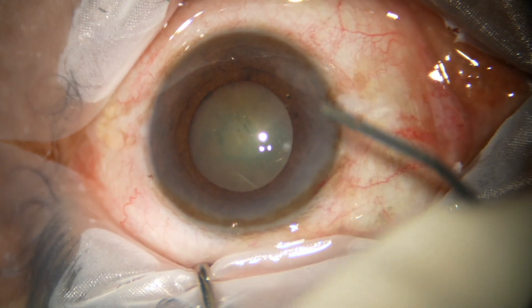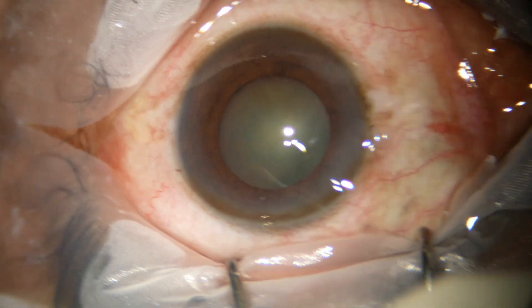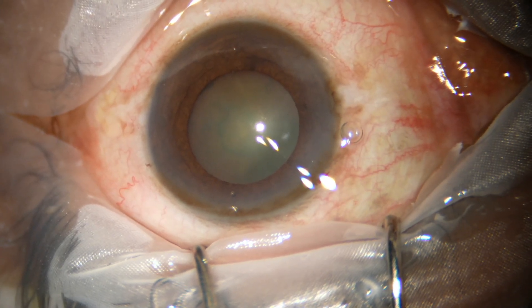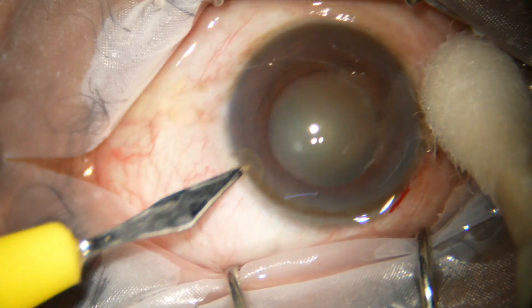However, in this case, I managed the nucleus without using any pupil expansion device. Let us see how the surgery was done. This is a minimally dilated surgery.